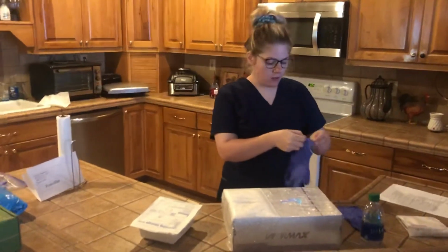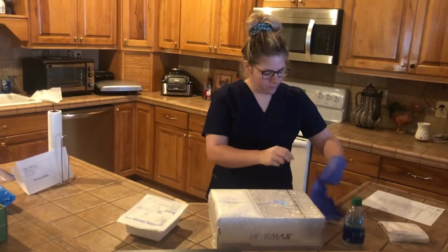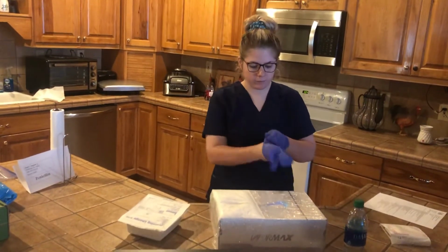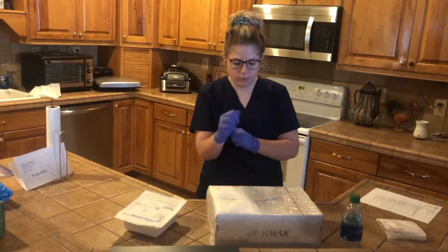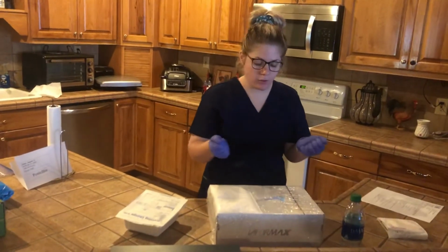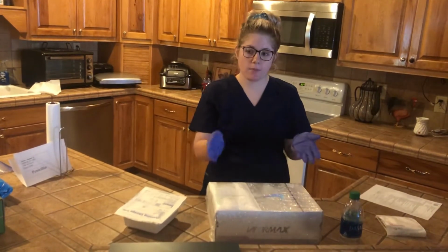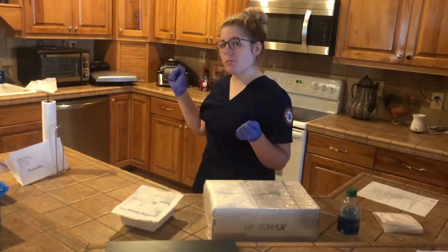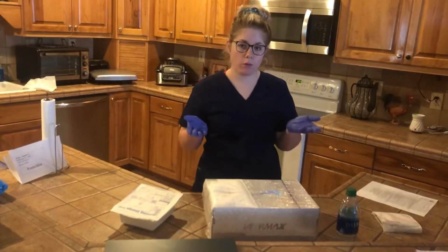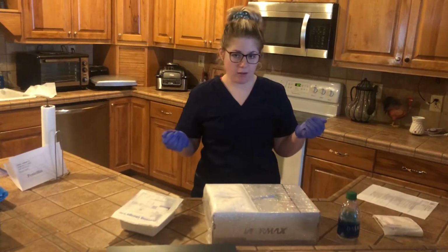I will put on gloves, and look at the suture, and I will also remove the bandage. I will expose the bandage on the patient and pull the curtain for privacy, while also raising up my patient's bed and lowering the side rails.